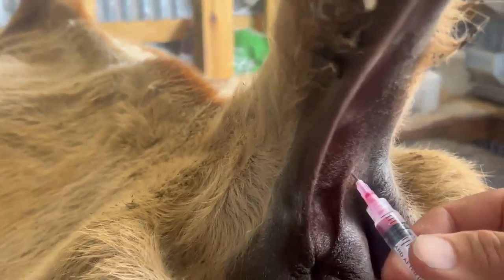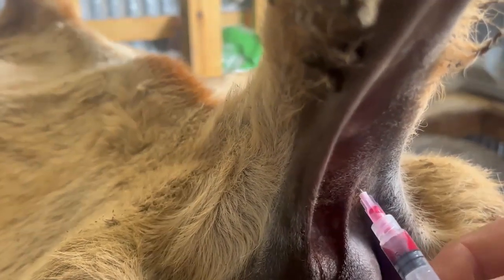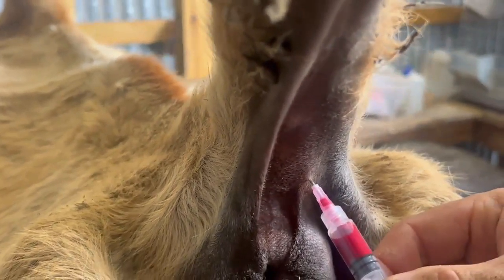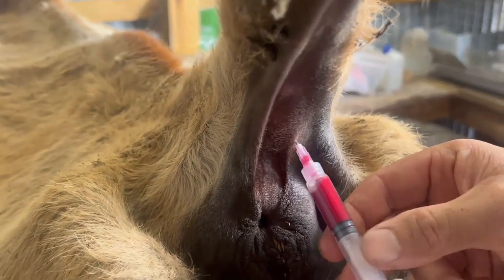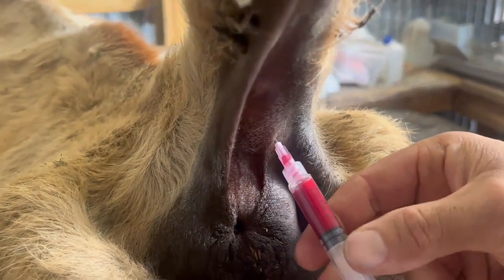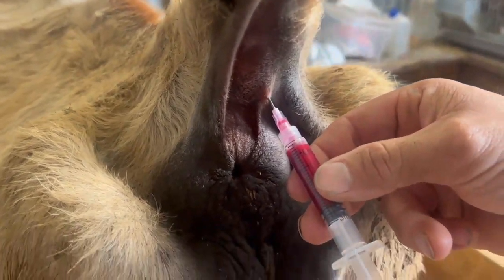There we go — looks like we're getting it now. Yeah, we're filling up slowly. We'll let it fill up slowly until we get two cc's. There we go, we're at 2.5 — not sure if you can see that — but we are good, so I'm going to pull it out now.